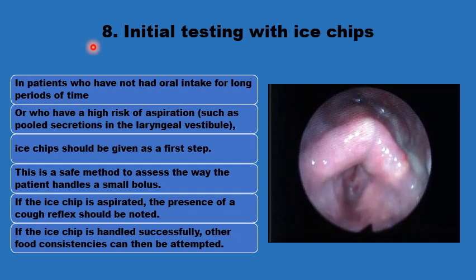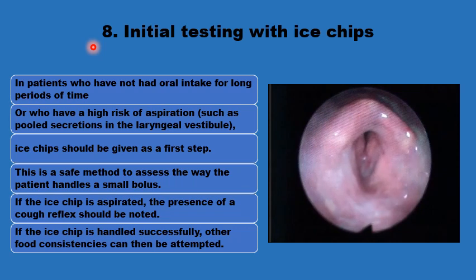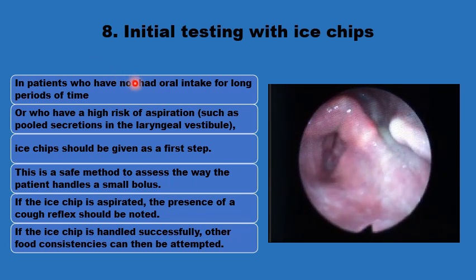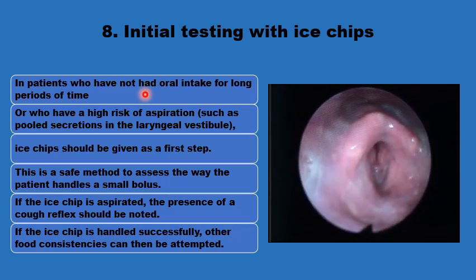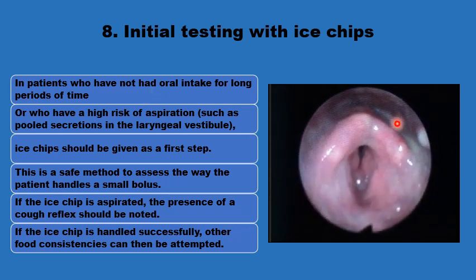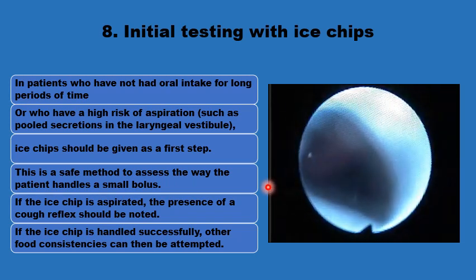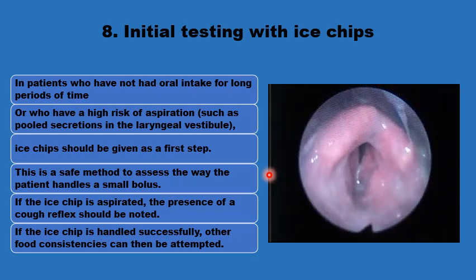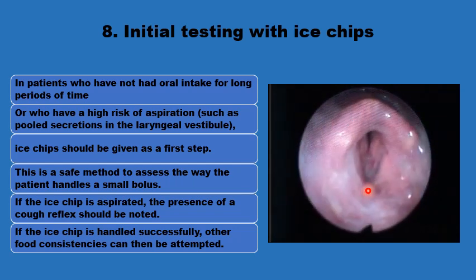The initial testing of the patients with ice chips before starting them on any colored food or drink would be required if the patient had not had any oral intake for a long period of time, or if the patient has retained secretions and pooling of saliva in the hypopharynx or the laryngeal vestibule. It's a fairly safe method. It maximizes the sensory input due to the coldness of the ice and also minimizes the risk of irritation or infection if it gets aspirated.